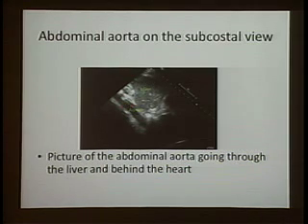And this usually pulsates. You can see the thing, boom, boom, boom. You may have a severe TR, and the IVC can pulsate too. Again, clinical context, okay? That will give you a good idea of the severity of TR. If you have a pulsating IVC with a reversal of flow in systole, that's a beautiful diagnosis. You have severe TR.